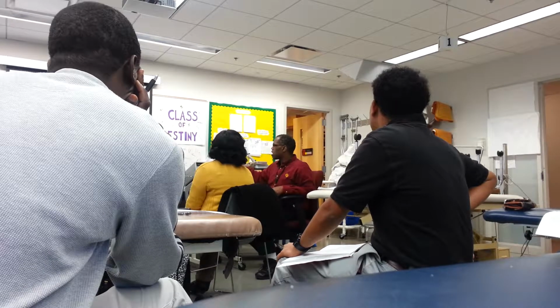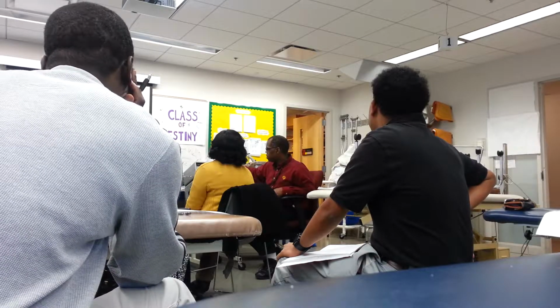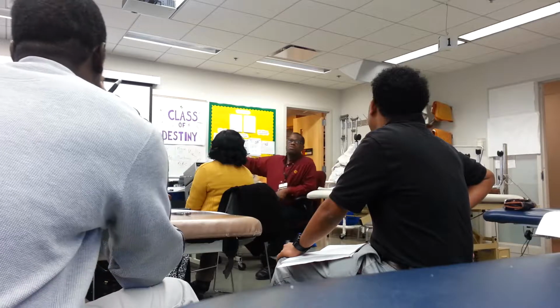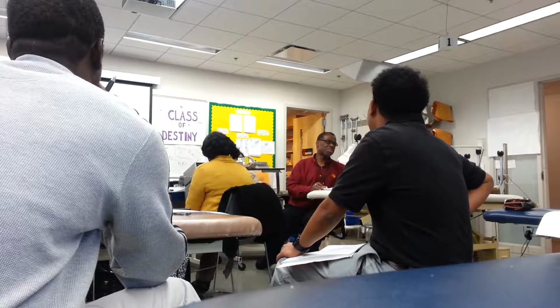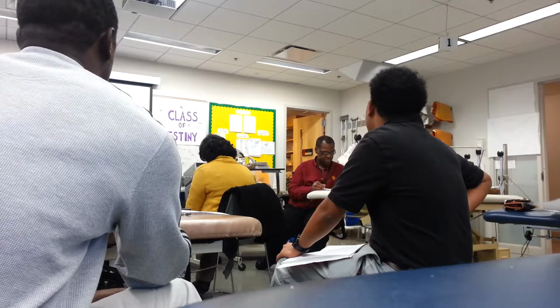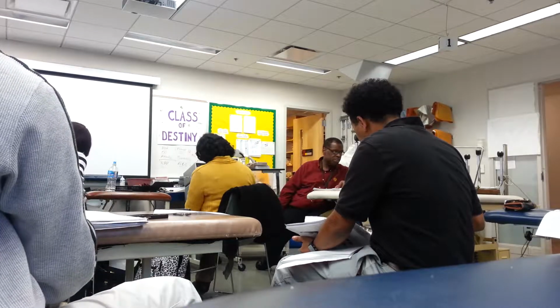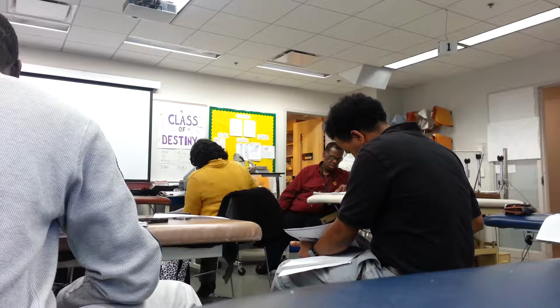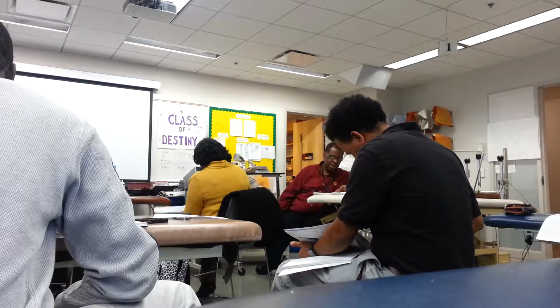So, what pulse rate might I want? 50. Pulses per second, pulse rate. What pulse width might you want? Think, if I keep talking, you'll figure it out. 50. Pulse rate, I want 50. It's on page 40. I want 50 pulses per second. On this machine, the pulse width is also built in at 50. All right. I want negative polarity and continuous.